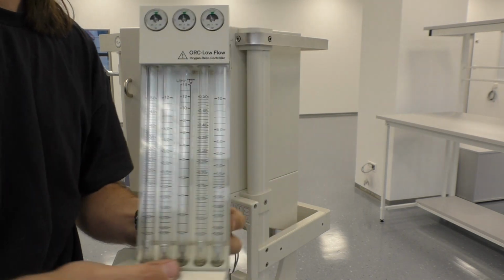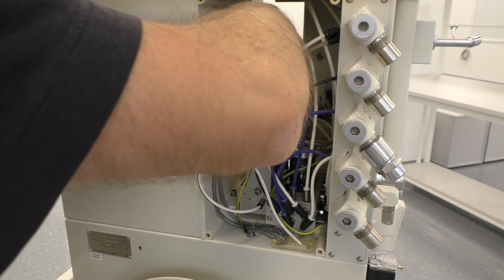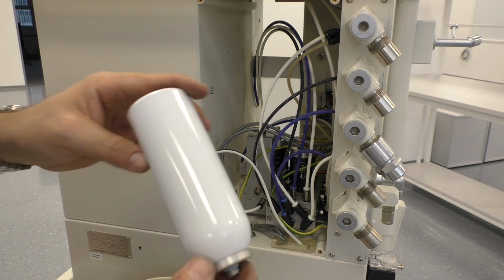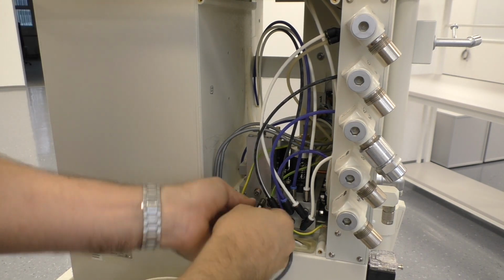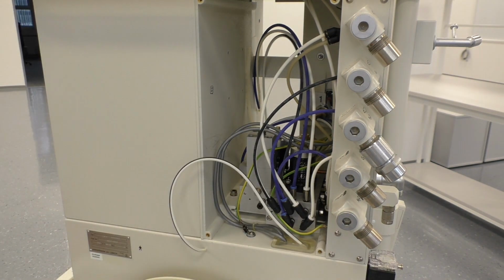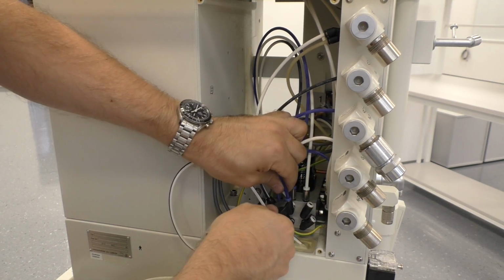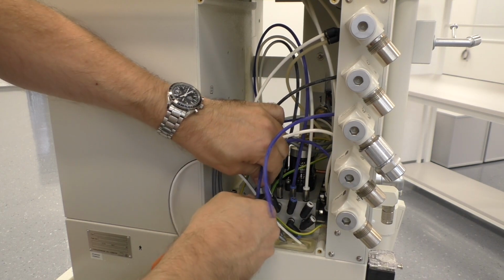Maybe I should put it on my desk. And that's the back side where all the hoses came from that went to this indicator unit. There's some sort of spray bottle, maybe a reservoir for oxygen, or I don't know what. I like these quick release connections here. If you have the right tool, they are even better. This is not the right tool, but it works. You have to push the ring in, and then you can simply pull that hose out.